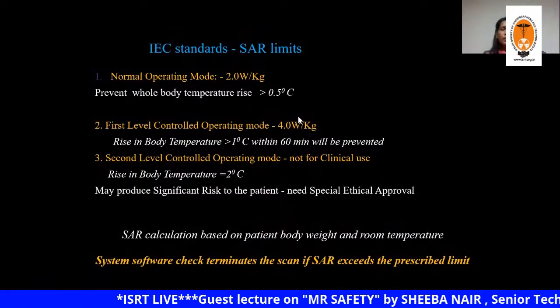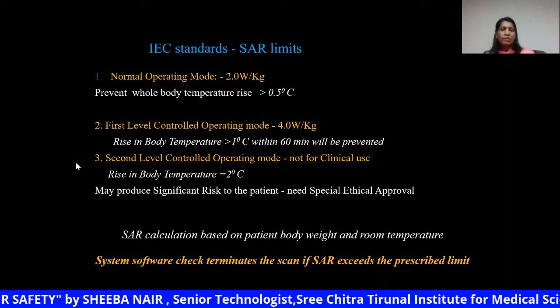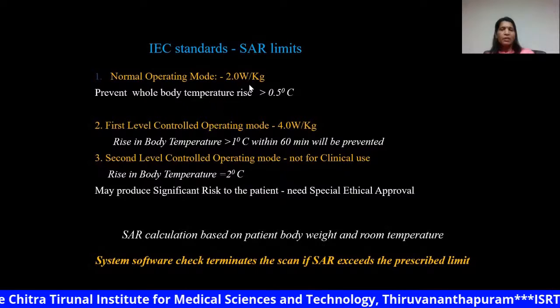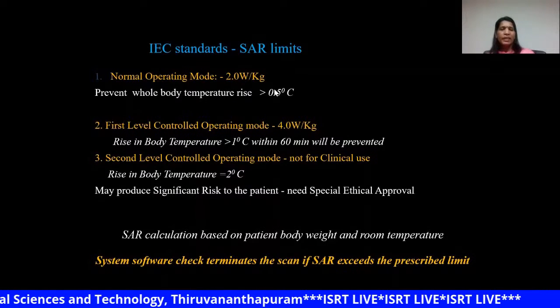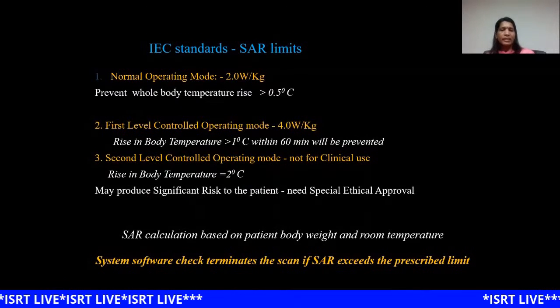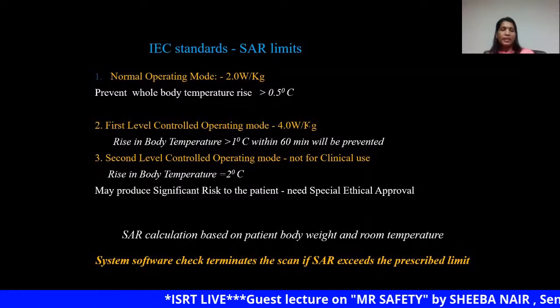So here, for avoiding any radiation related injury to the patient, the system will be provided with different operating modes. Once we choose scanning in the normal operating mode, the maximum energy deposited will be 2 watt per kg, and the system will automatically terminate the examination if the body temperature rises by 0.5 degrees centigrade.